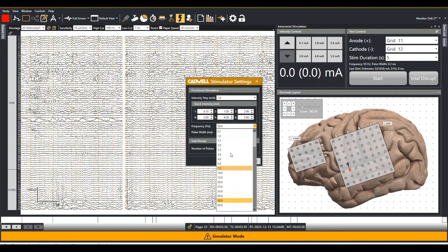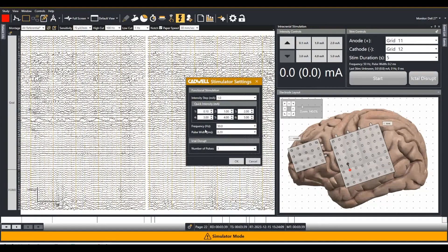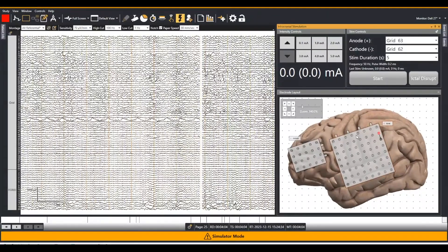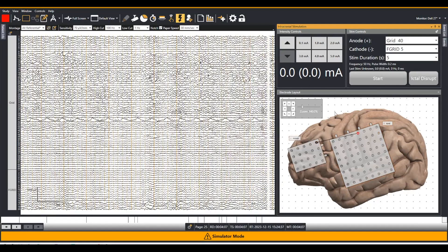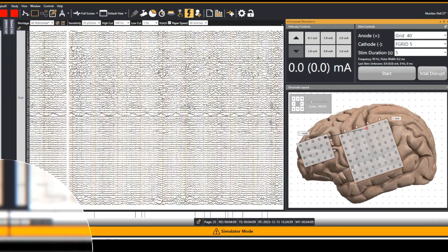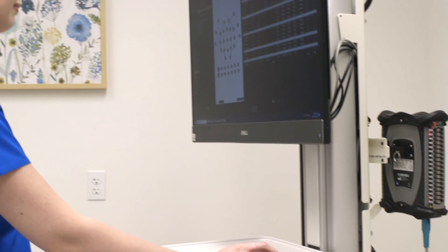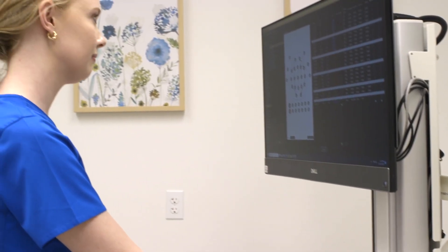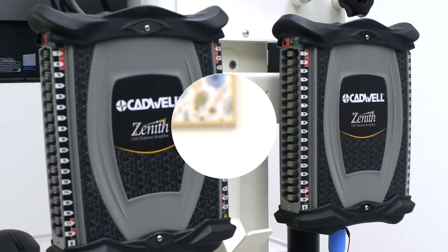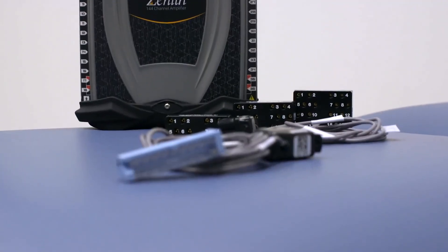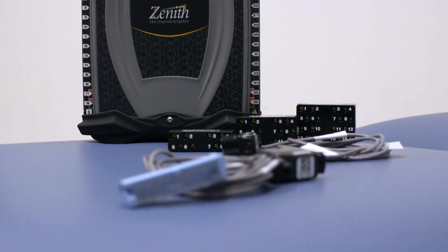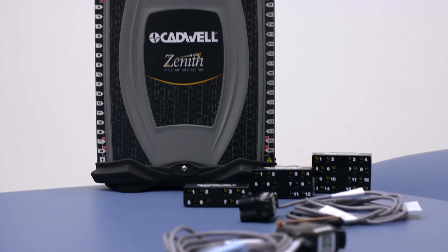Document cortical stimulation, functional responses, and after-discharge responses with graphs and tables automatically integrated into reports. ARC EEG will change the way you help patients through their neuromonitoring journeys. Discover which EMUs are already using ARC Zenith and schedule your demo today at cadwell.com.